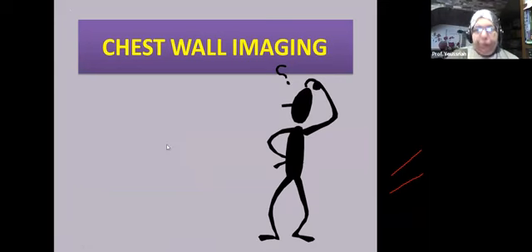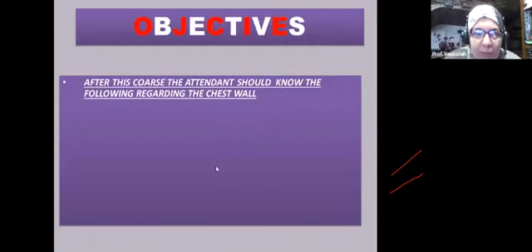Now chest wall imaging. What do we need to know?